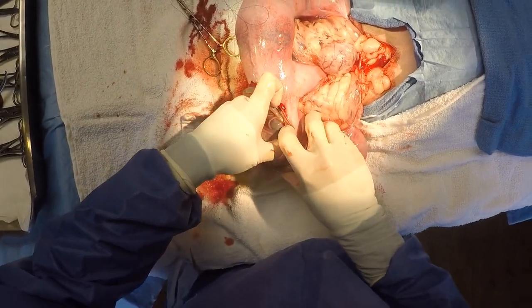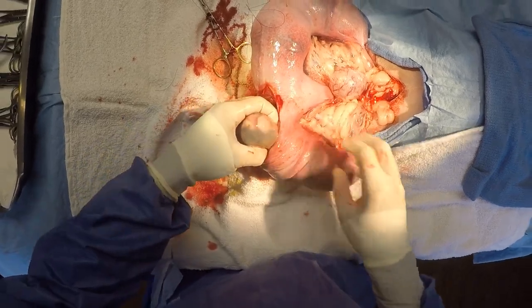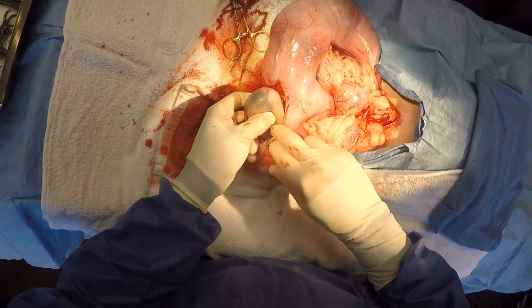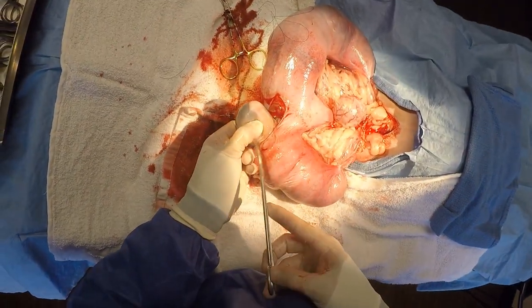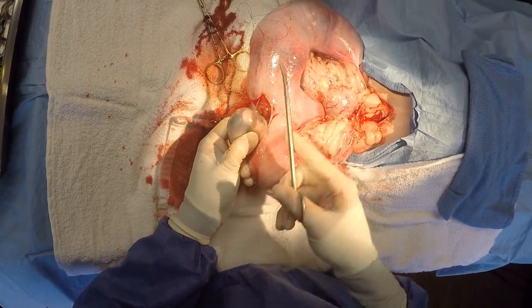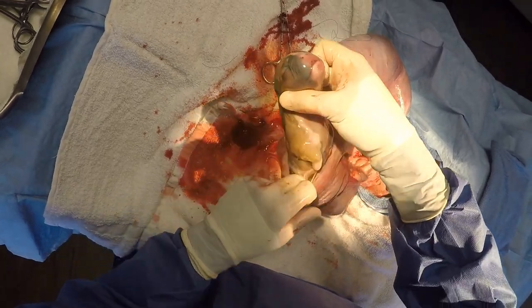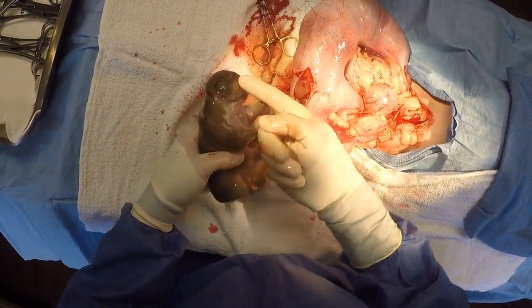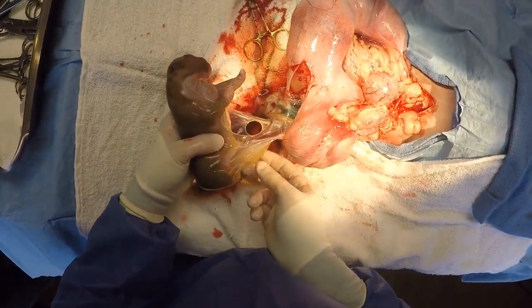This procedure is continued exactly the same way with the second puppy. As you can see, we're grasping the second puppy — that's the head of the second puppy right there. Once again, a pair of scissors will be used to make a little incision through the placenta in order to remove the placenta from around the puppy's head, face, and body. This procedure continues the same way: tying off the umbilicus, presenting it to a staff member, and having them revive the puppy.